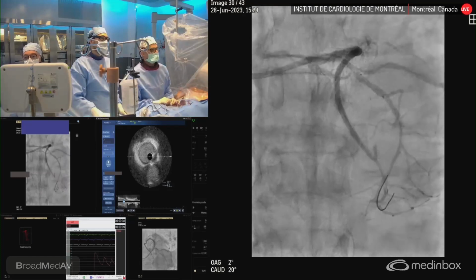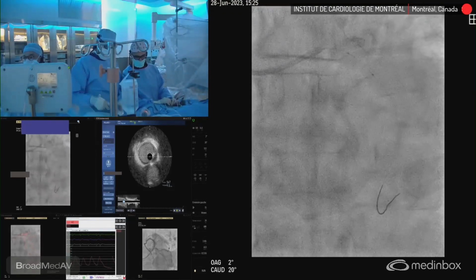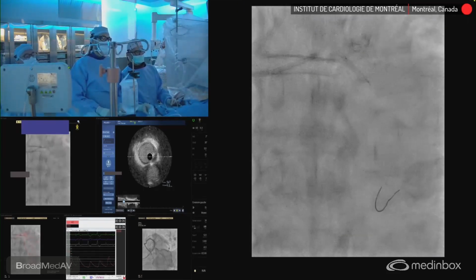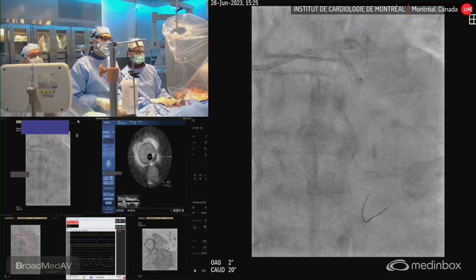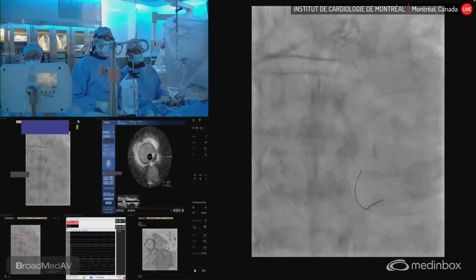So the team is positioning the catheter. Maybe there's another question I can answer while Robert is getting the enabled therapy. Yeah, so Josephson, thank you. He would use rotational and IVL, so supporting what we're doing. So thank you, very encouraging. Again, there's always that unknown how the vessel will react, how the nodule will react. Sometimes it's not so easy to really break, and you will attack the other side of the vessel. But at the same time, with lithotripsy, I think we have a chance of breaking, changing the plaque modification, the calcification. Other question?